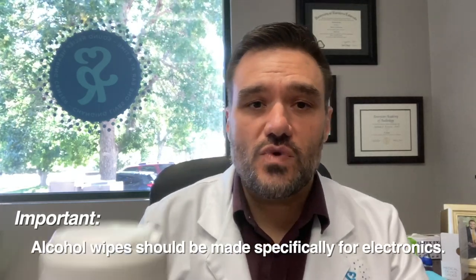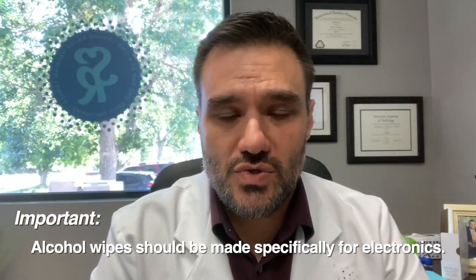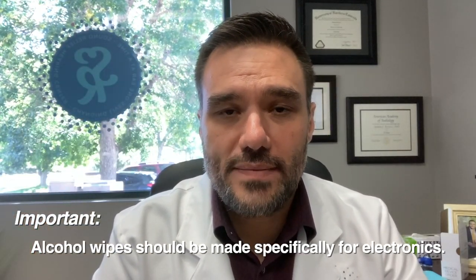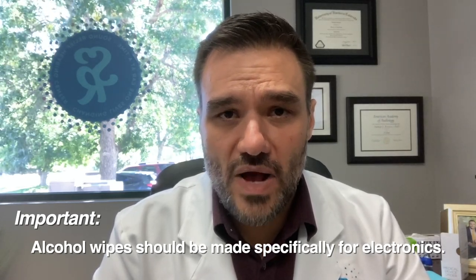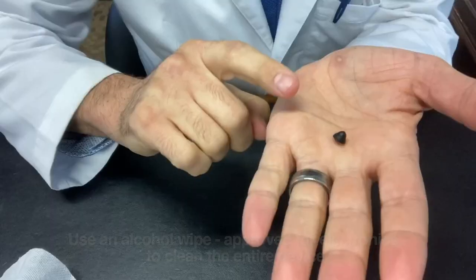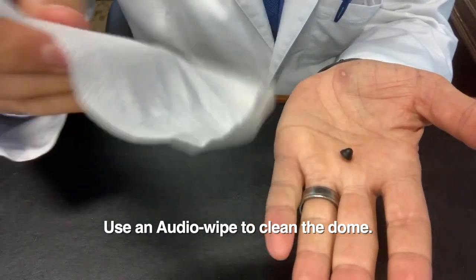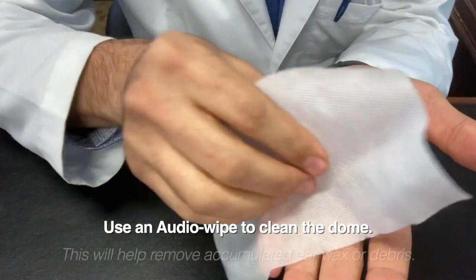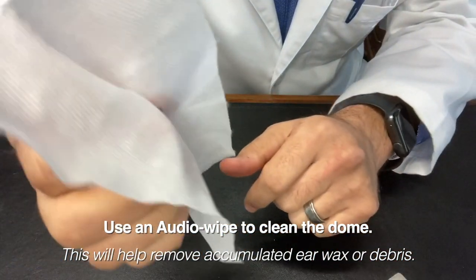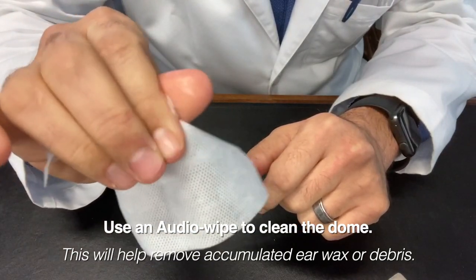Here at Sound Relief, we use audio wipes, which are specifically designed for devices. If you're in a pinch, you can use an alcohol prep wipe, but it is recommended that you use audio wipes if possible — they're just designed specifically for electronics. I just wipe this whole thing down. I also want to clean this dome, so with my audio wipe or alcohol prep wipe, I'm going to put that dome directly into the wipe and then mash it around with my fingers a little bit to clean out any wax that has accumulated within the dome.